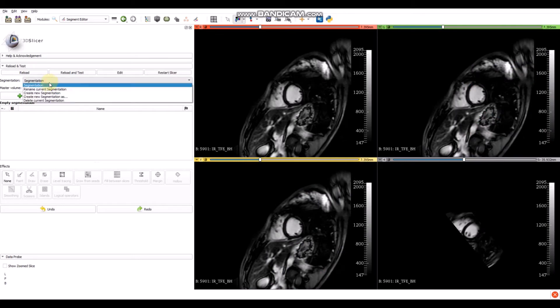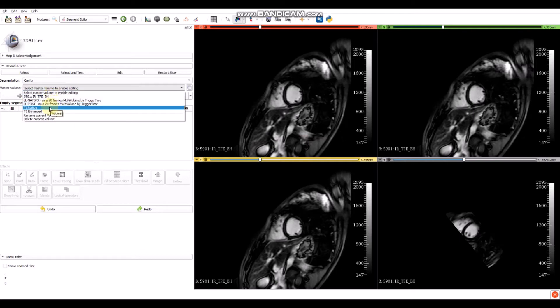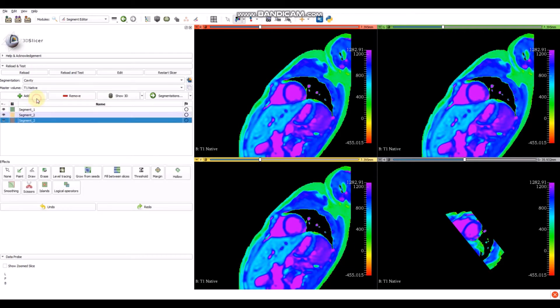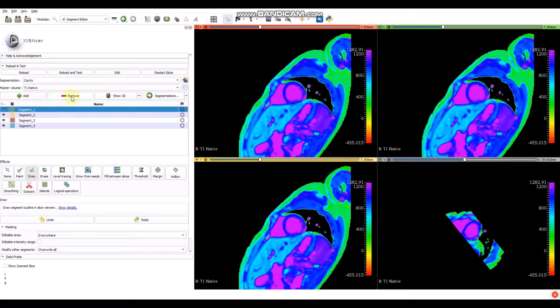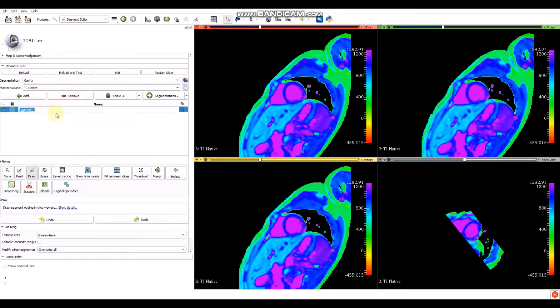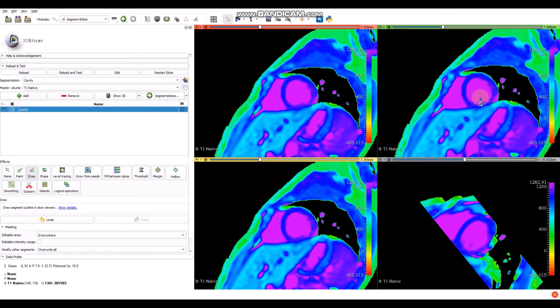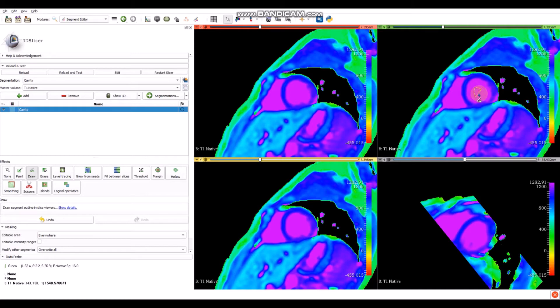Click on the segment editor module and then create a new segmentation — 'New segmentation as' — and we will call it 'cavity'. Select the volume that you want to create the ROI or the segmentation on; in this case it will be the T1 native. With the Add button, we can create segmentations. We can change the name of the segmentation to 'cavity'. With the Draw button, we can draw a new segmentation on the image. We can zoom in on the image with the right-click of the mouse and make the segmentation.